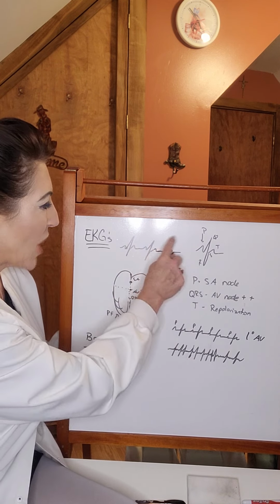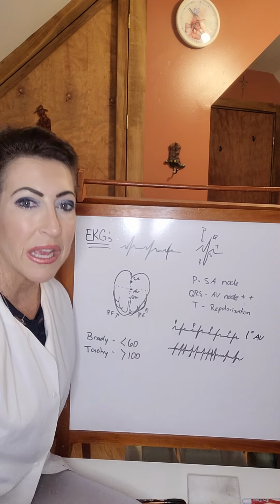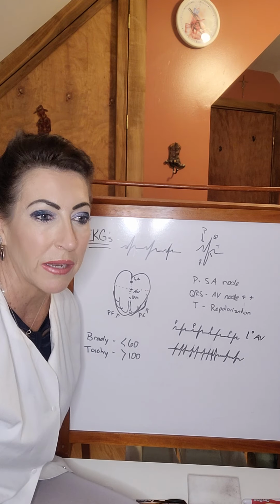Like, these don't march out, like you can kind of measure them out and then there's a hesitation. Or there's PVCs where there's additional beats, like there's patients forever telling me that, well, my heart skips a beat.